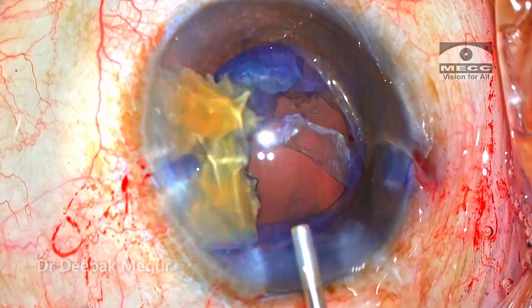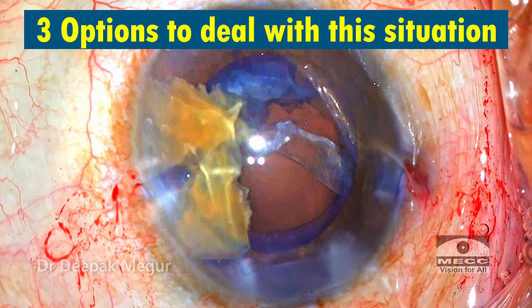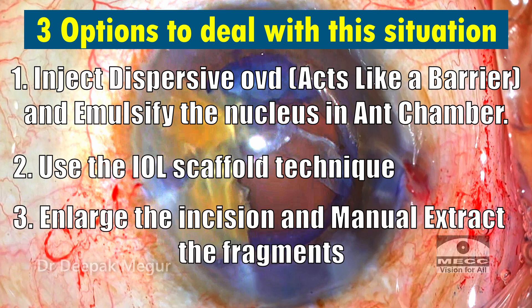As I'm pushing in OVD, I take a pause to reassess the situation and plan the next maneuvers. I'm thinking of three options. Option one: put in dispersive OVD, hope it acts like an effective barrier, continue emulsifying the two fragments in the anterior chamber, and deal with the epinucleus using a cutter or otherwise. Option two: use the IOL scaffold technique popularized by Dr. Amar Agarwal — put in a multi-piece lens first and then emulsify these two fragments. Option three: either enlarge the incision and extract these fragments manually, or create a fresh small scleral tunnel and extract them manually.